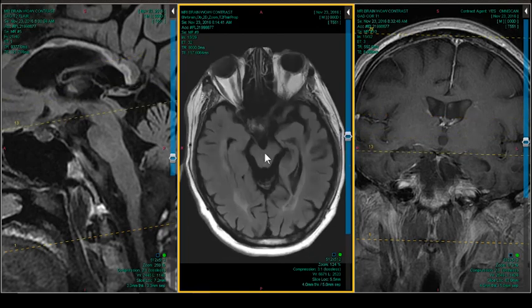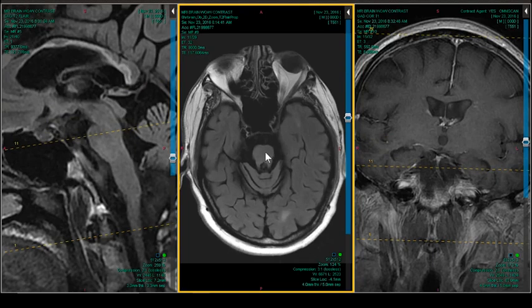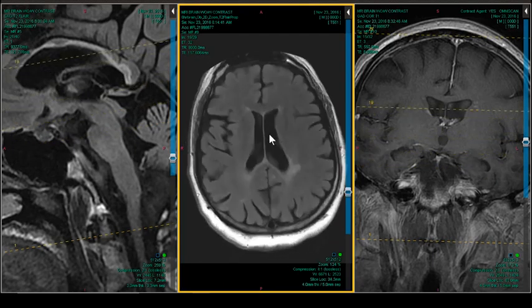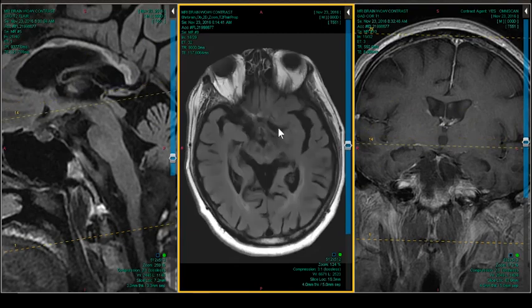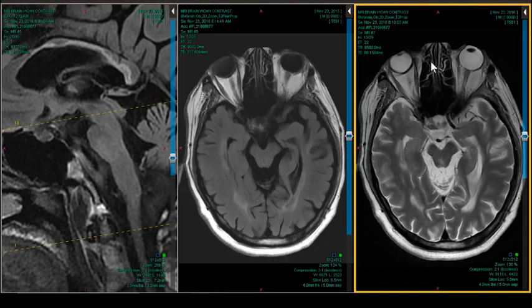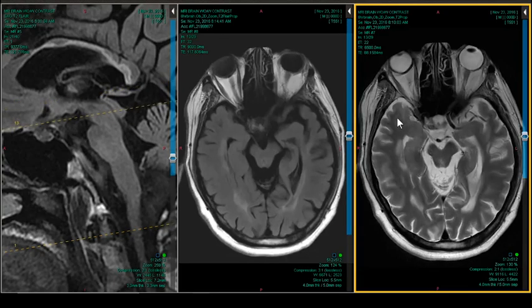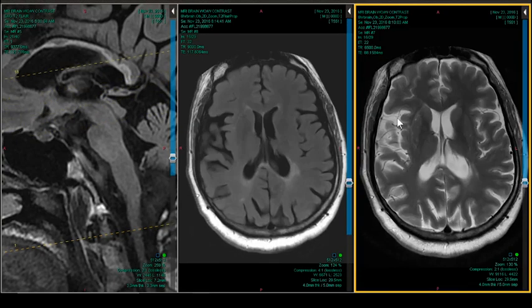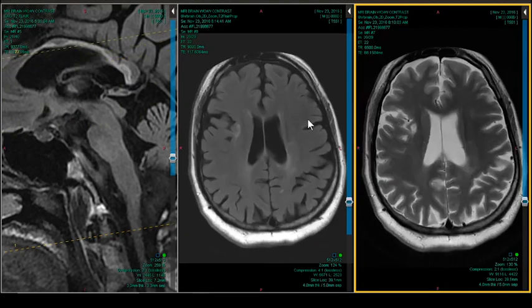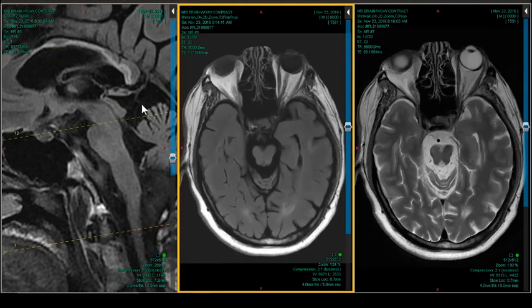And the entire cortex is atrophic, isn't it? So there's no way this could be NPH with gyri and sulci this big, because that often comes up in almost every case. So I'd like you to think about the differential diagnosis that you would generate. And Alzheimer's wouldn't be in there. So you've already eliminated an important one. Pick's disease, or what should now be called frontotemporal lobar dementia, that really shouldn't be in there.